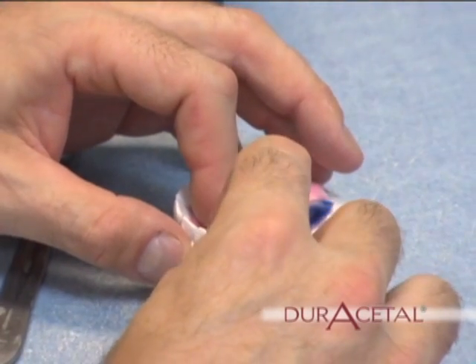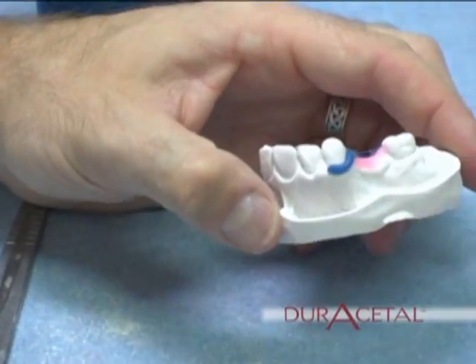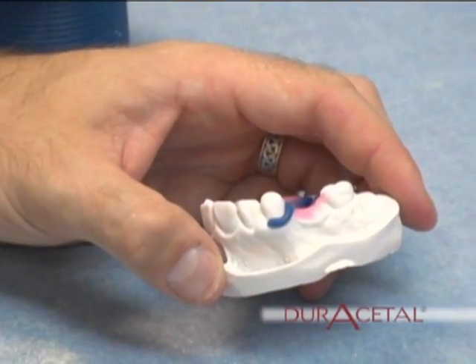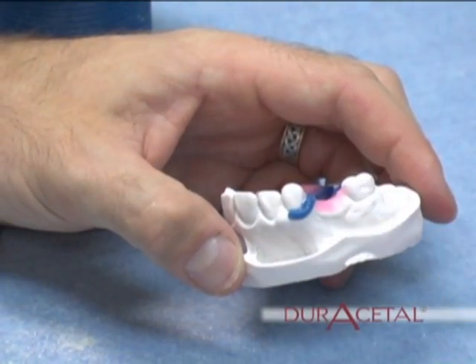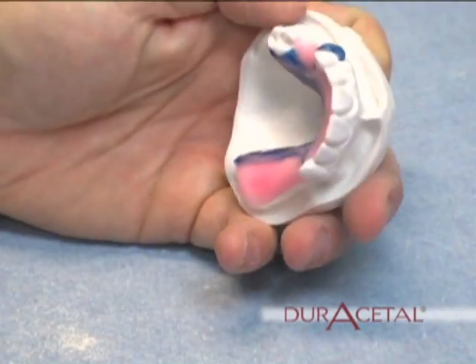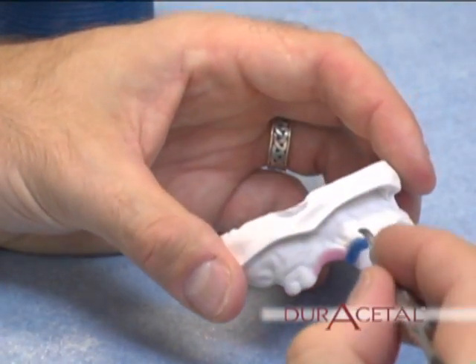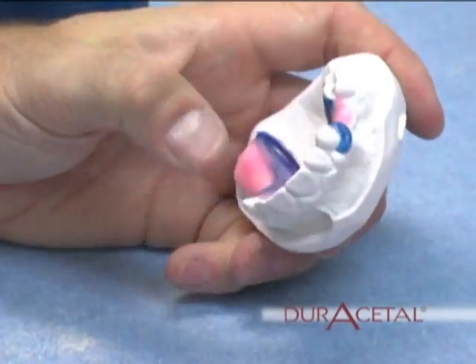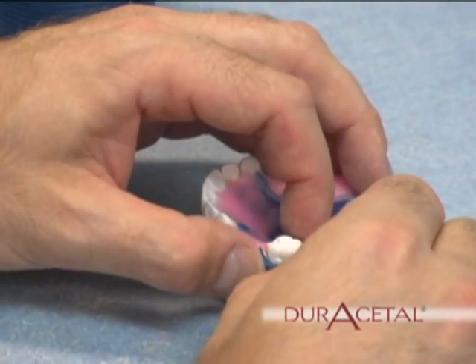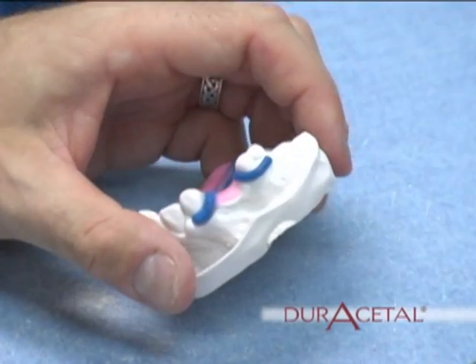Waxing the clasps. With your major connector waxed, now move on to waxing the clasps. About 90% of the time, the clasp will be placed at the gingival of the tooth. But if there is an extreme undercut, you will need to move the clasp higher on the tooth. Place 12 gauge rope wax to form your clasp. The thickness of the clasp is only for processing — once the clasp is processed, it can be reduced. With hot wax, seal the rope wax on the tooth.